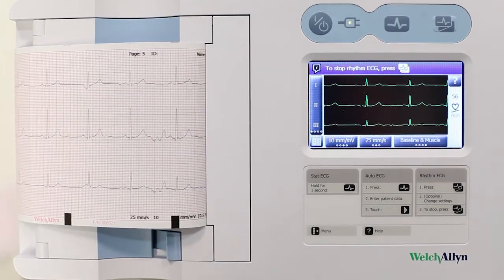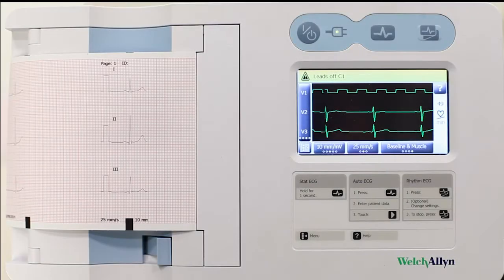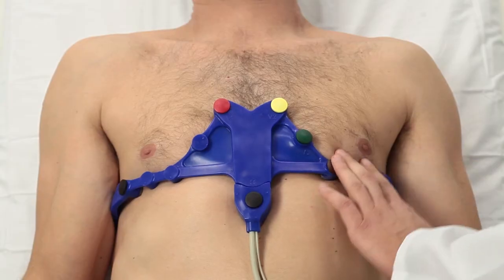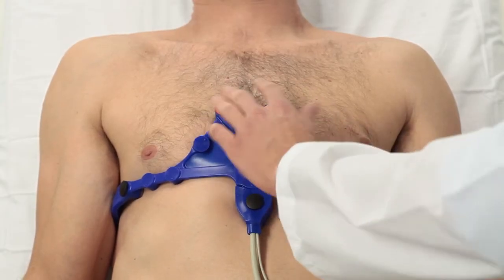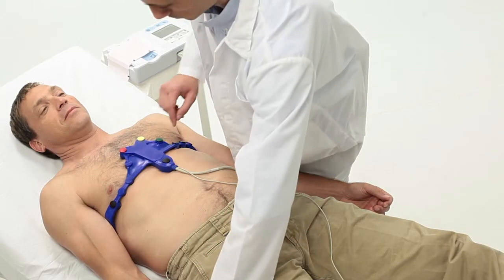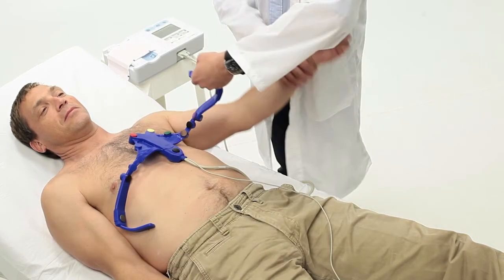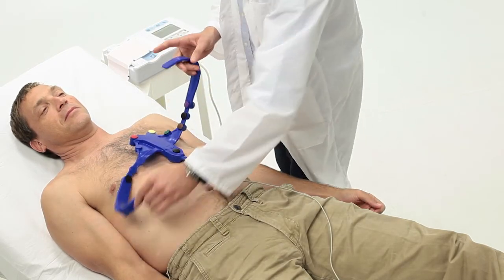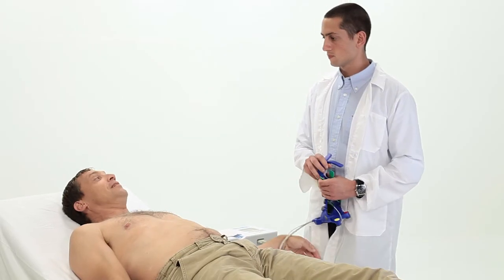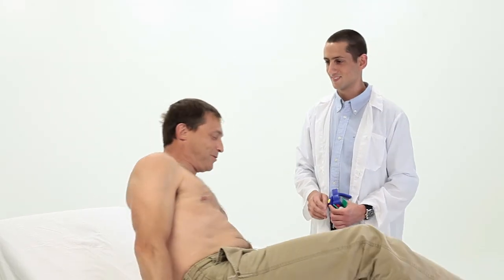Obtain ECG readings and ensure a good signal is displayed. In case of artifacts or lack of signal in one or more electrodes, make sure the electrodes are in contact, and if necessary, re-wet the electrodes with spray. Once the reading is obtained, you can easily remove the belt and clean it with LevMed disinfection wipes. That's it — the next patient ECG assessment can begin.